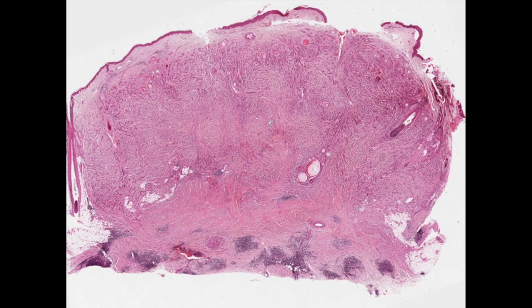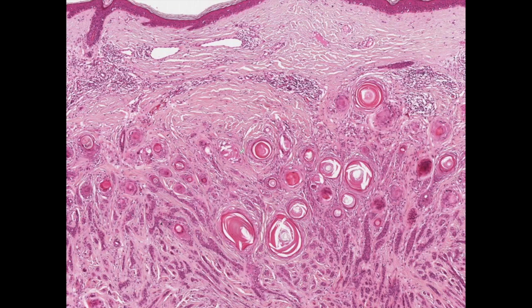The lesion is located in the dermis and invades into the superficial subcutaneous tissue. It's similar to our case. It can be hard to appreciate the biphasic component at low power, follicular and tubular differentiation. At higher power, the follicular formation can be seen well here. Here we can see follicular horn cysts or keratocysts, cysts with pilar keratinization. And this one looks a little bit like a tadpole. Whenever you see a structure like this, we think about syringoma as well. And syringoma is a common differential diagnosis of MAC.